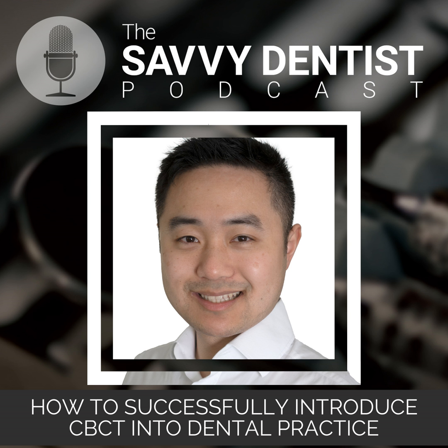The other business aspect is there's a wow factor to viewing everything in 3D. Absolutely. I think it's more intuitive to look at your jaw, look at your teeth, and the way things are. So for example, impacted teeth, and looking at the degree of resorptions and the degree of damage to the surrounding structures, it is so much easier to look at it on the 3D film. Yeah. So when you have that in front of the patient, it's so much easier for them to say, I see the problem, and therefore I'm more than happy to accept the treatment. So in a lot of ways, CBCT is an enabler. It's like the workhorse behind the scenes.